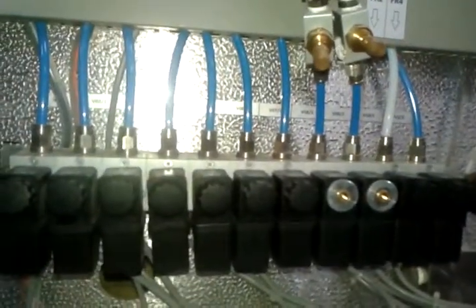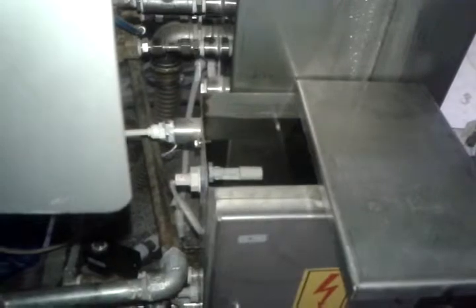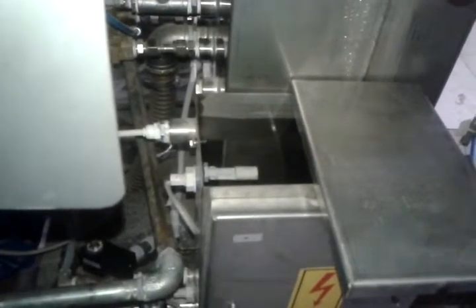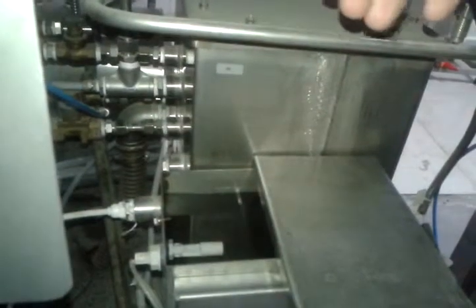We have a mineral-free reservoir here. So we fill up first with mineral-free water — about 8 liters. This mineral-free water tank is feeding the steam generator with mineral-free water.